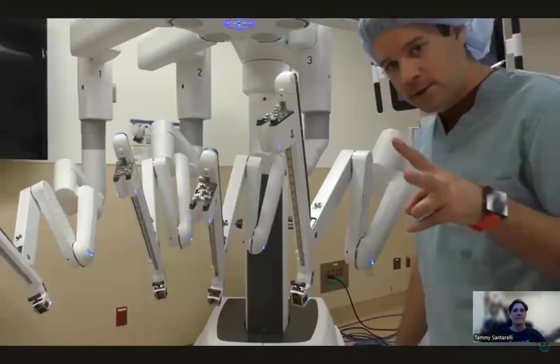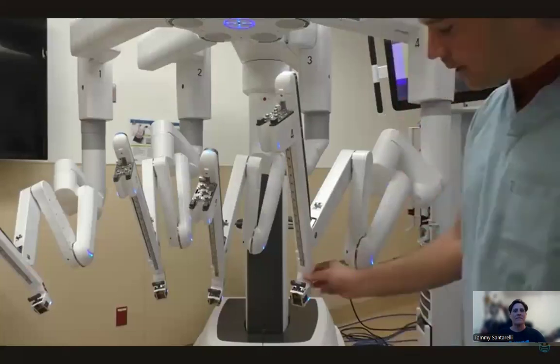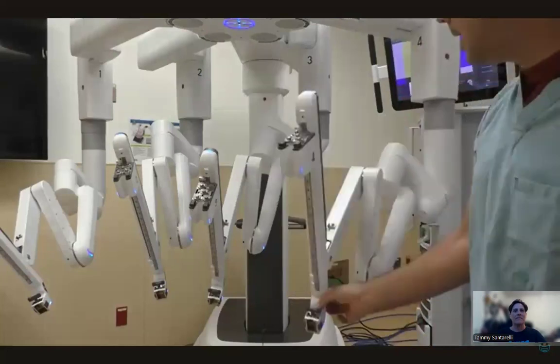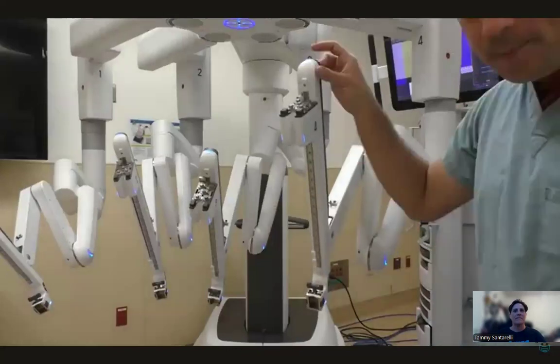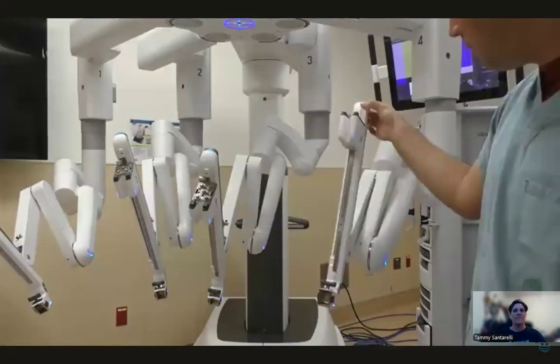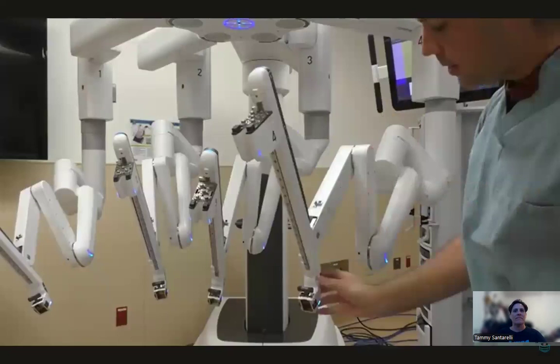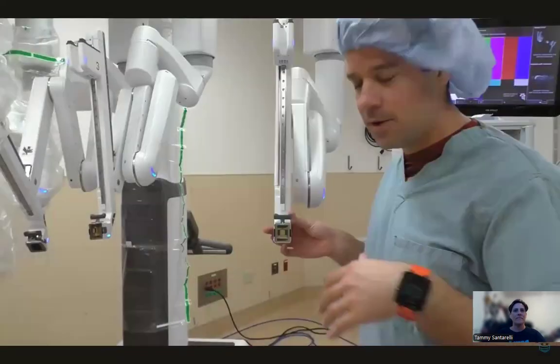Now we have two more buttons that are attached to each of these arms. We have one button here at the bottom of the hand, I like to say, and that's going to move side to side, up and down. And a button up here that's going to angle left, right, forward, and backward. All movement directly from the elbow here. This movement is coming back from this.